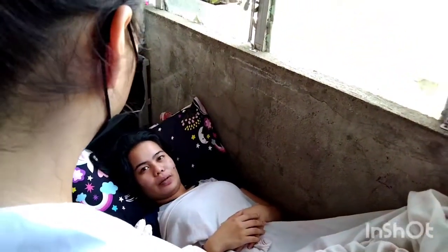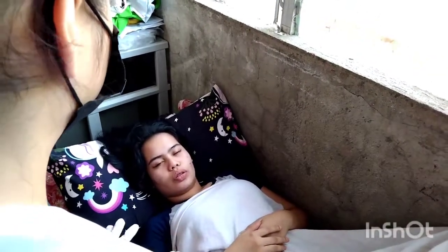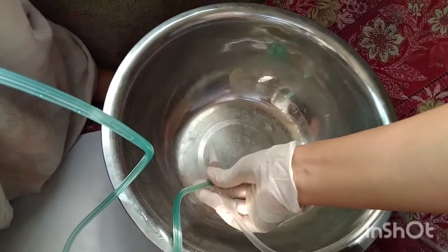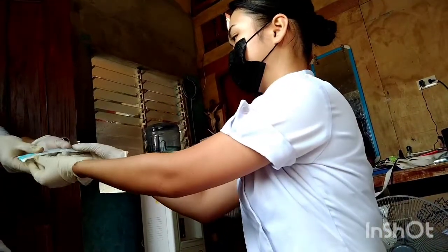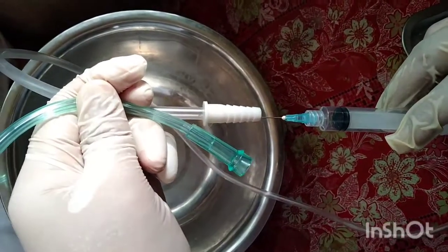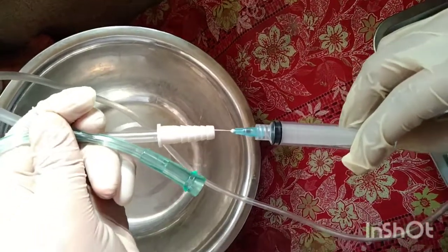Step number 16 is to instruct client to breathe through the mouth while doctor inserts catheter to the urinary meatus. Relaxation of external sphincter aids in insertion of catheter. Place distal end of catheter in sterile bowl to measure urine volume or attach the drainage bag as indicated. Offer 10 cc syringe filled with distilled water to the doctor to inflate inflation balloon. Attach end of catheter to collecting tube of drainage system unless already connected to bag. Place drainage bag in a dependent position.